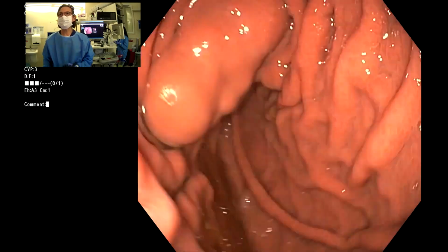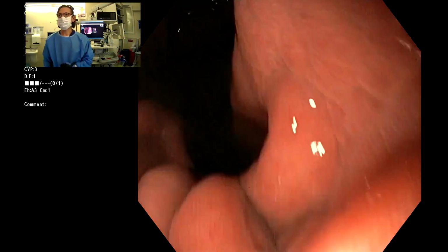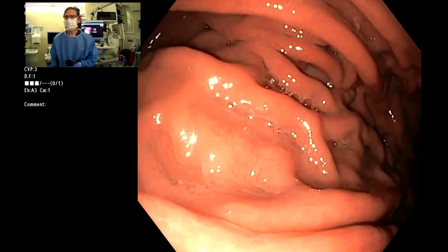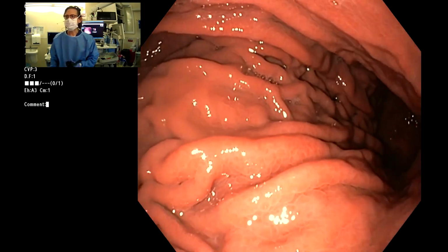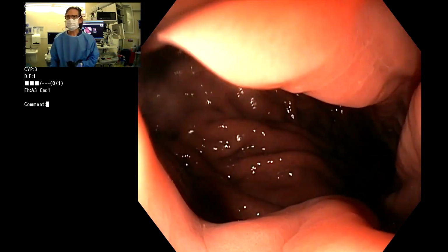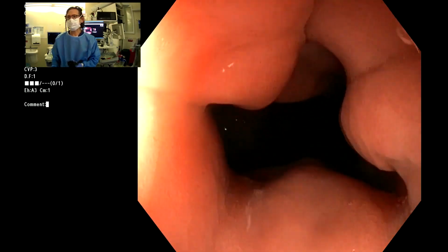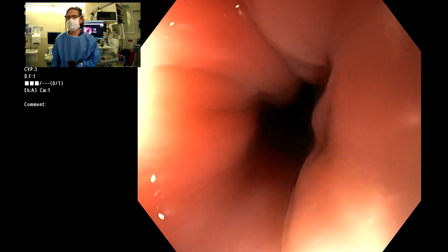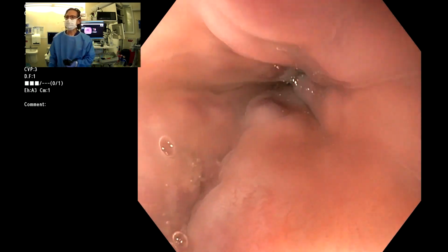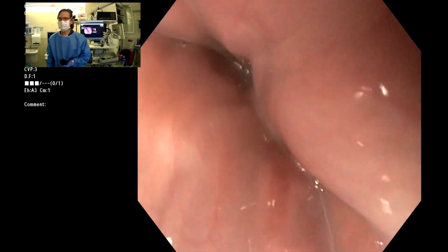So the vessel that straddles the wall of the stomach fundus connected with collaterals. Typically for these varices in the fundus, patients have a large gastrorenal shunt, so we're going to look for that as well. And we want to make sure that we plug up the fundic varices well with a couple of coils before the glue, to ideally prevent embolization of the glue after injection.